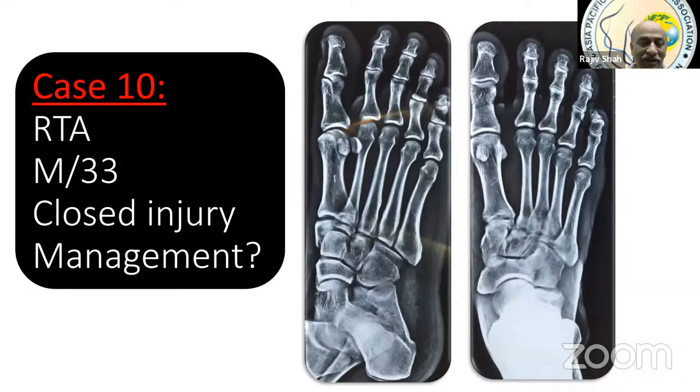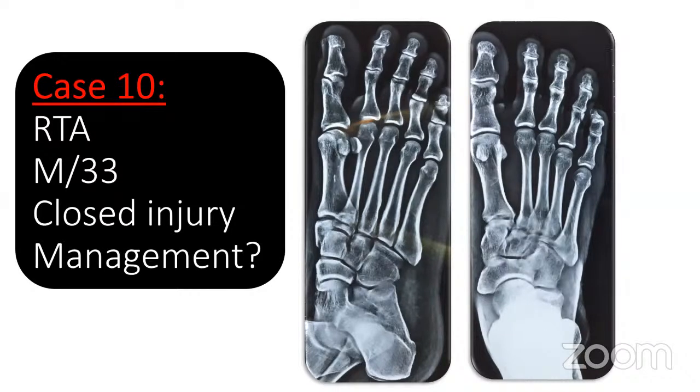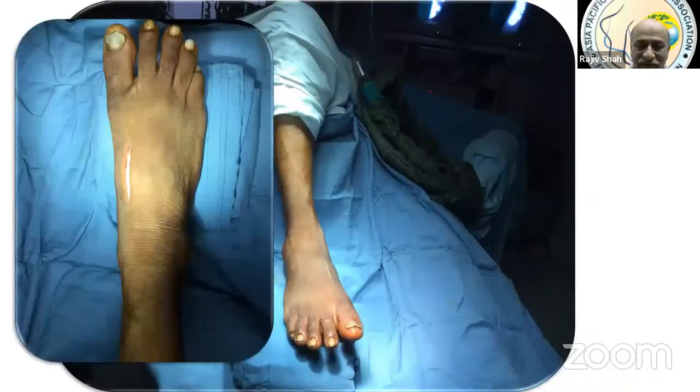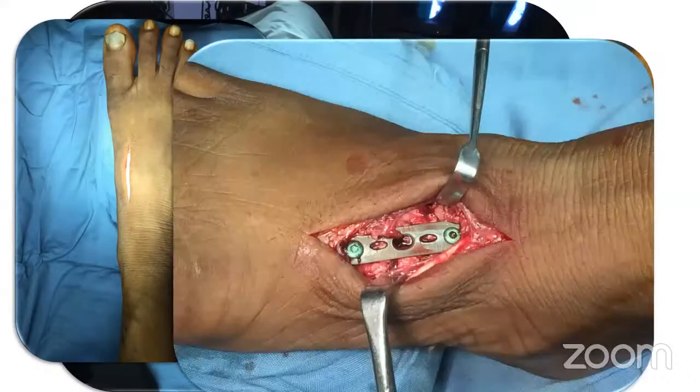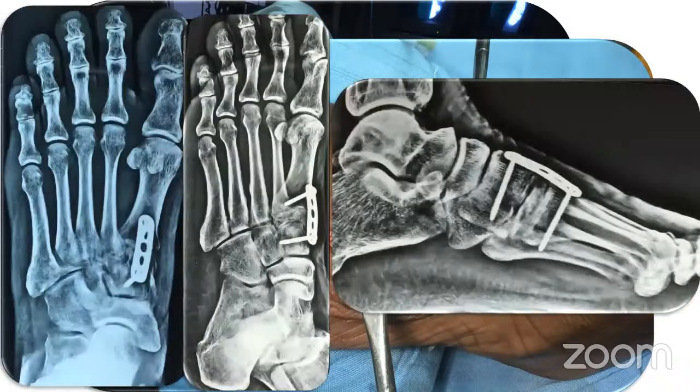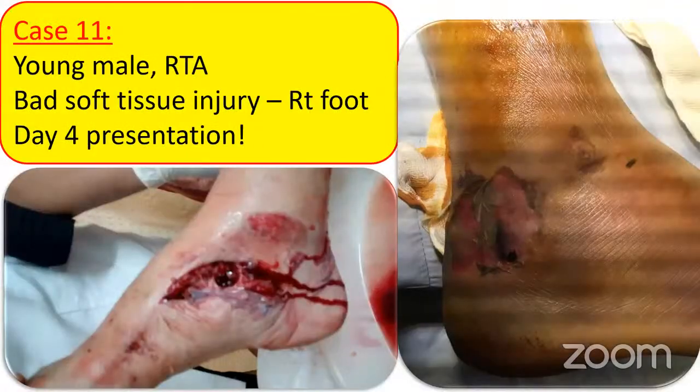But look at this. This was a road traffic accident in a male, 33 years, closed injury, managed by Dr. Hari, sir. Sir, it has to be distracted and fixed, sir. Yes, definitely. So I opened it, distracted it, and put in a bridge plate. And this plate would be removed at the end of 4 to 6 weeks.